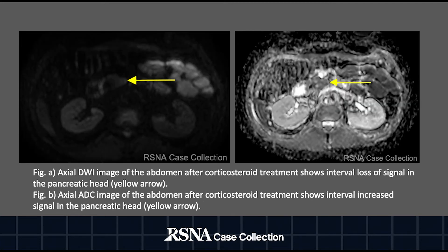Lastly, in figure A, an axial DWI image of the abdomen after corticosteroid treatment shows interval loss of signal in the pancreatic head. And in figure B, an axial ADC image of the abdomen after corticosteroid treatment shows interval increased signal in the pancreatic head, denoted by the yellow arrows.